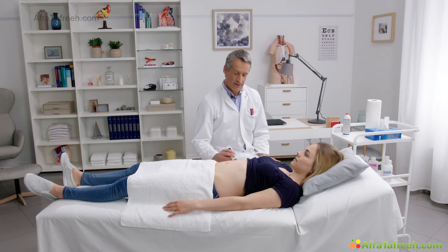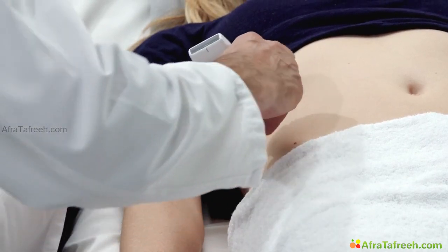Now I would like to demonstrate how to scan both kidneys. We are starting with the right kidney, the patient lying in a supine position, and we can visualize the right kidney in a longitudinal and a transverse view.